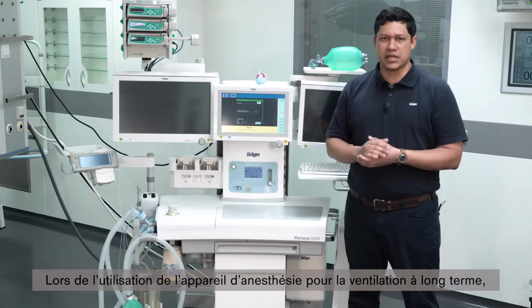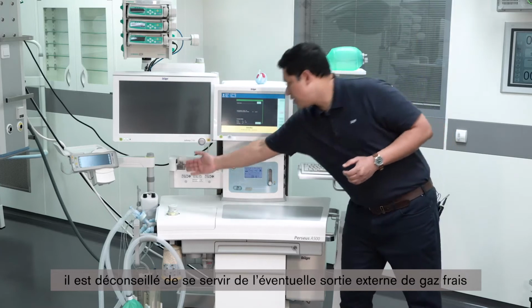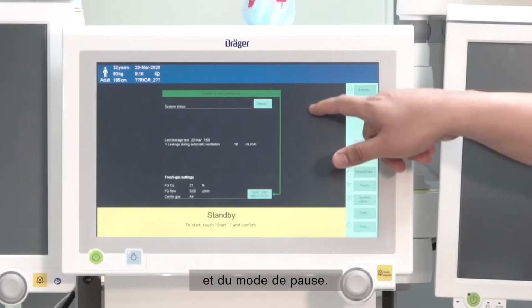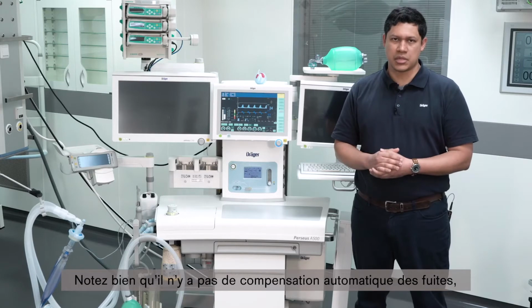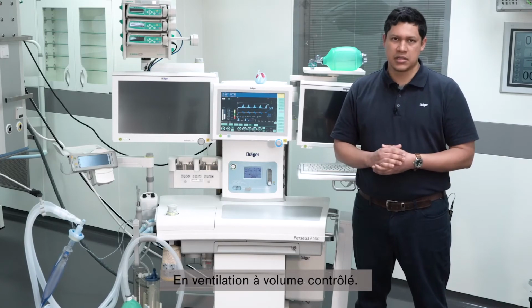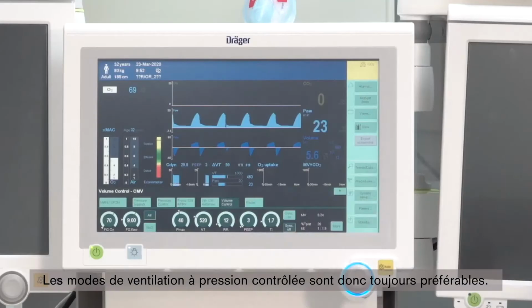When using the anesthesia device for long-term ventilation, it is not recommended to use the external fresh gas outlet if available, neither the pause mode. Keep in mind that when using volume control ventilation modes, automatic compensation of the leakage will not be in place, so pressure control ventilation modes are always preferred.